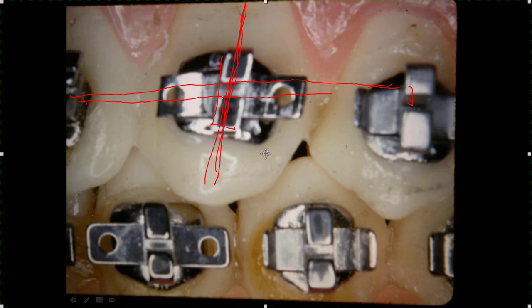If you've got a wire in here that fills the slot of the bracket - I like to use an 018, or 18-thousandths bracket slot. A lot of guys have gotten hooked on 022, or 22-thousandths. So that's four thousandths bigger than the 18 bracket.